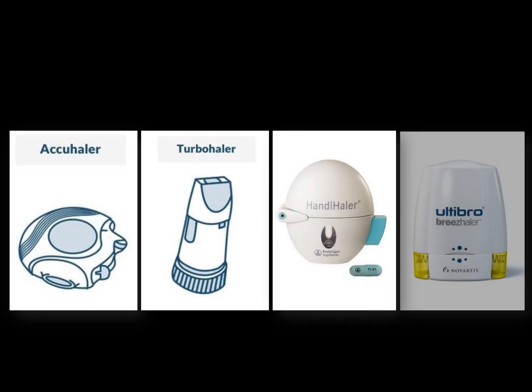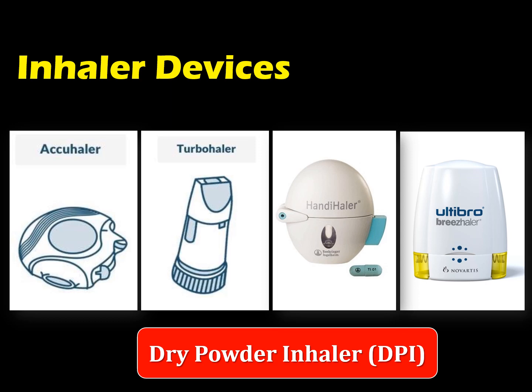Next, we have dry powder inhalers. Dry powder inhalers are breath-actuated devices that deliver the drug in the form of particles contained in a capsule or blister that is punctured prior to use. This type of inhaler requires adequate inspiratory flow rate for drug delivery, as it does not include a propellant, versus the MDI. So this is dependent on the patient himself or herself.